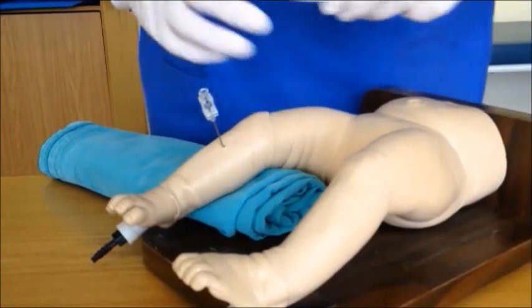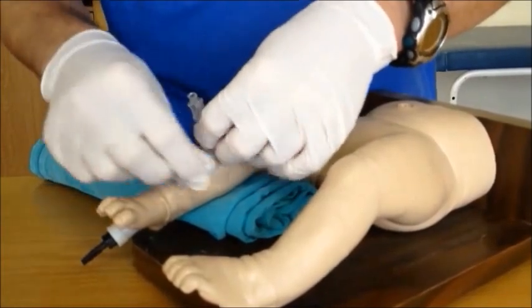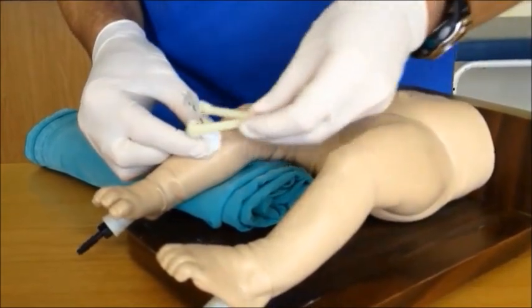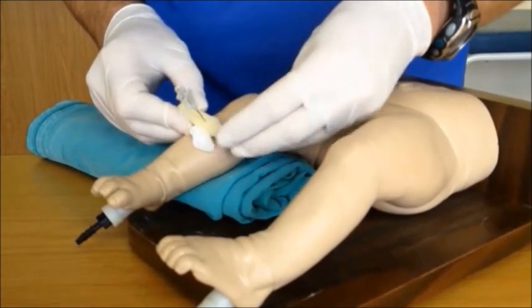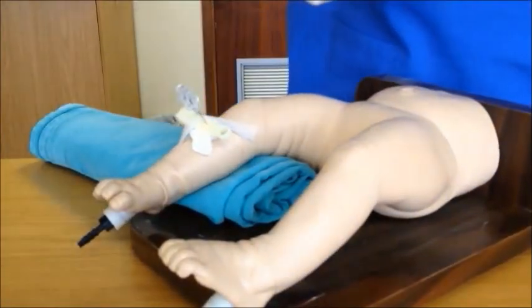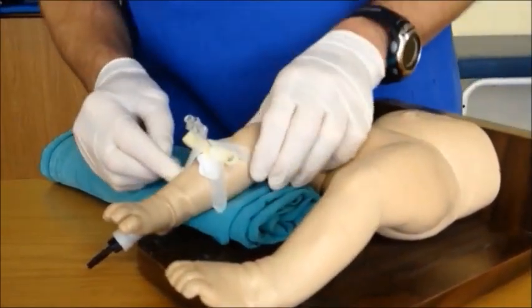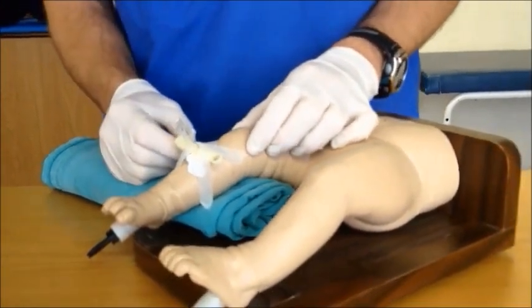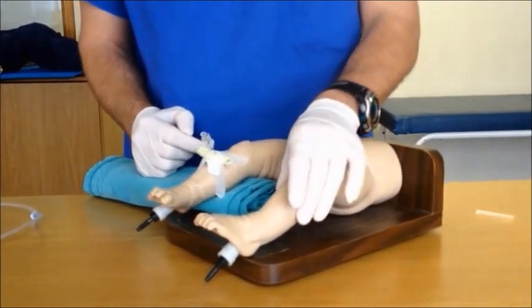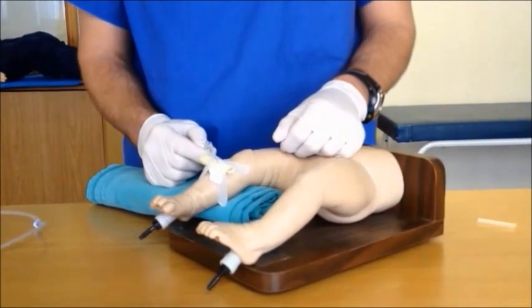One technique that has been described starts off with a roll of gauze that is placed against the skin at the base of the needle to protect the skin from any pressure. You can then take an umbilical clamp, press it down and click it in place. The final step would then be to use some tape to secure it to the patient. Do not use a lot of circumferential tape, as it obscures the leg for visual inspection and regular palpation of the calf compartment to prevent extravasation. A constrictive circumferential bandage would increase vascular compartment pressures in the case of extravasation, increasing the risk of compartment syndrome.